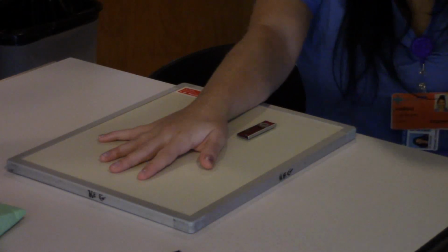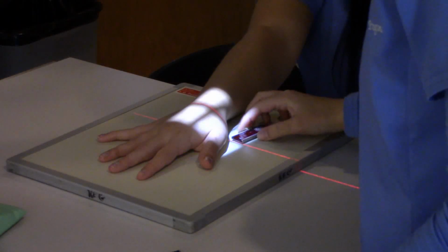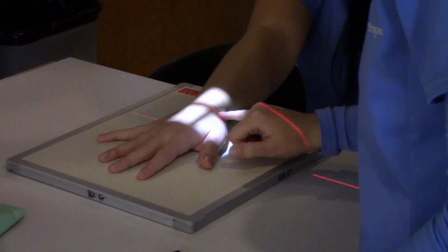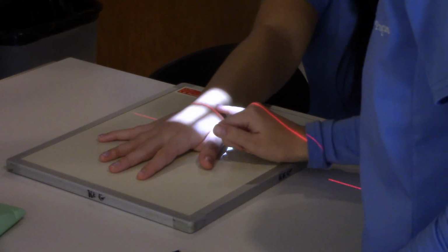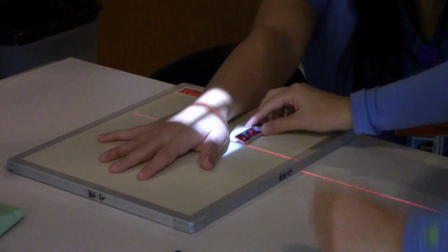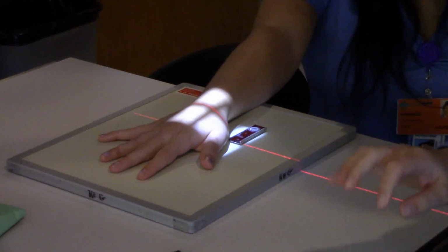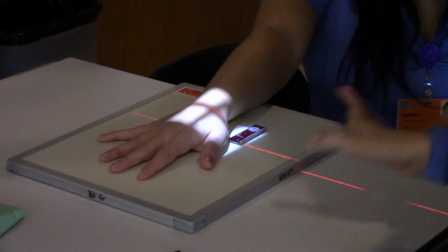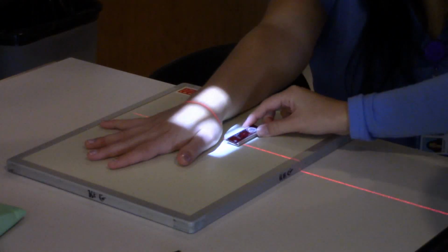That's between 10 and 15. Do we need any deviation on this one? Yes, we do. What kind of deviation? Ulnar deviation. Ulnar deviation. All right, thank you, patient.